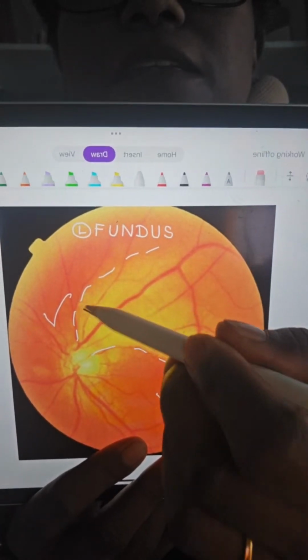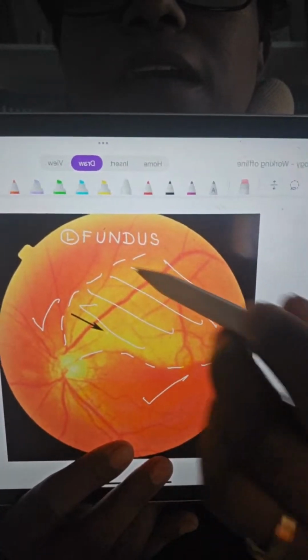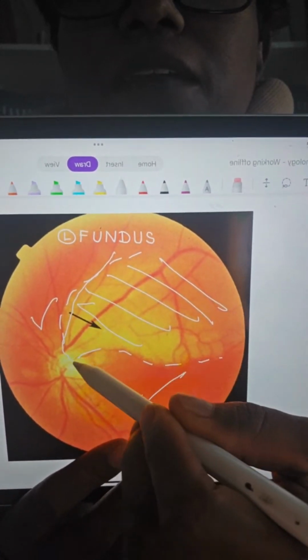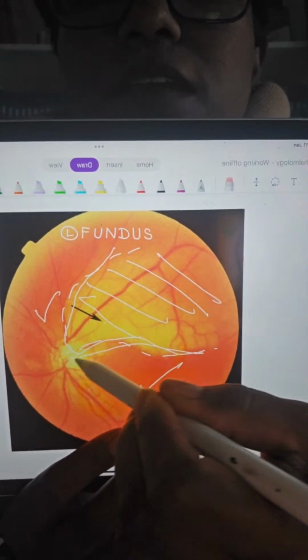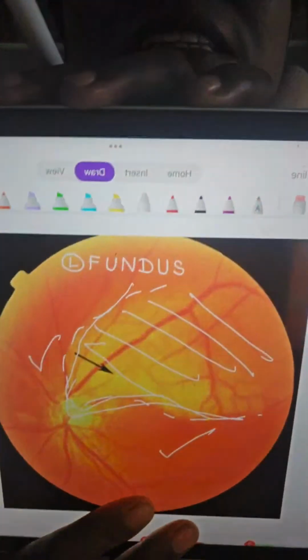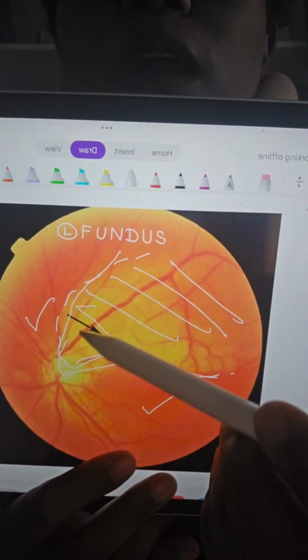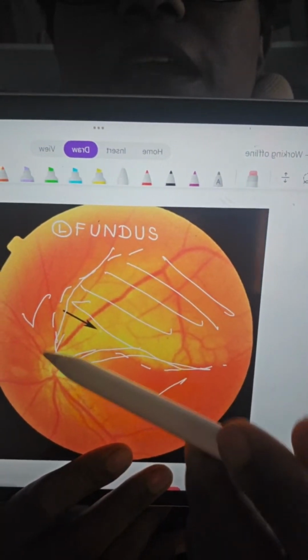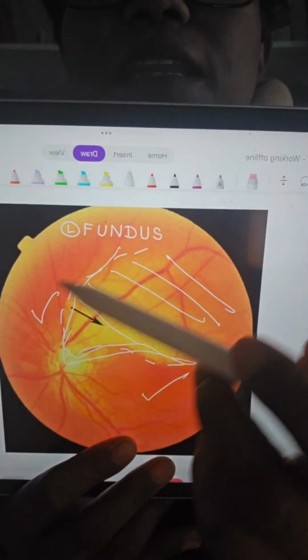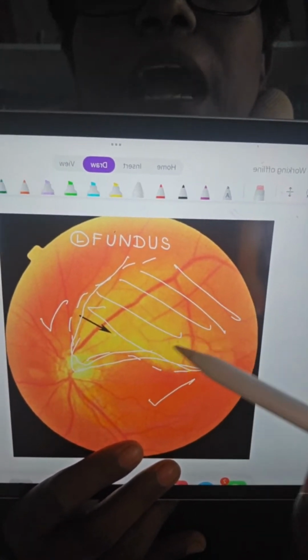But in this area, do you see the opaque retina? The retina here in this quadrant is opaque. Very good, Shweta. Yes, so it is opaque. So you get a milky white, although I know that's a bit of an exaggeration. Milky white. So this quadrant, yes, it's a milky white retinal edema. So this is a superotemporal branch retinal artery occlusion.